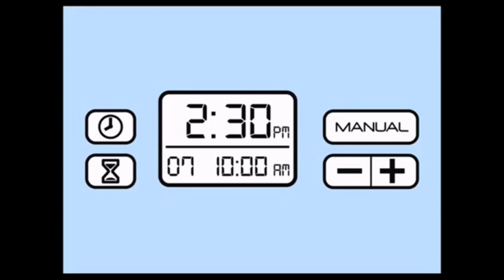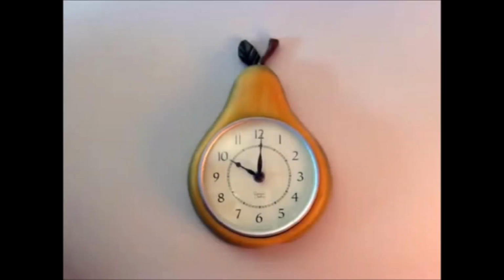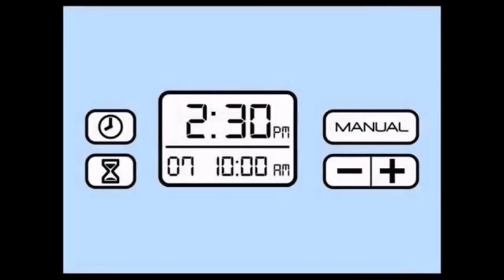If you prefer your clock to display in the 24-hour military time format, press the plus and clock buttons simultaneously. You will then be prompted to choose either the 12 or 24-hour format. The SoClean comes preset to start a 7-minute cycle at 10 o'clock a.m. every day. If you wish to change these settings, it's easy.